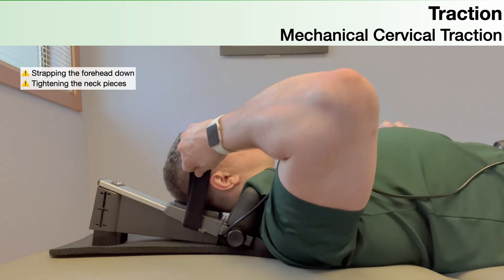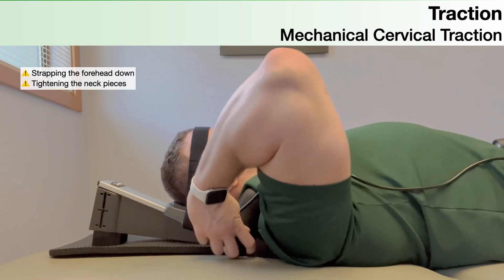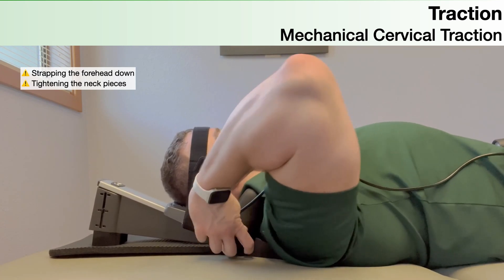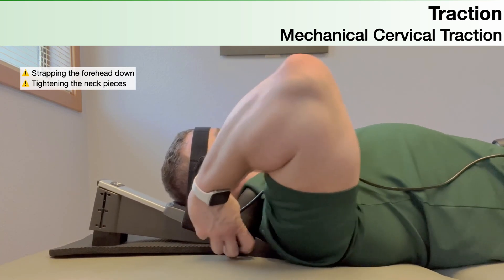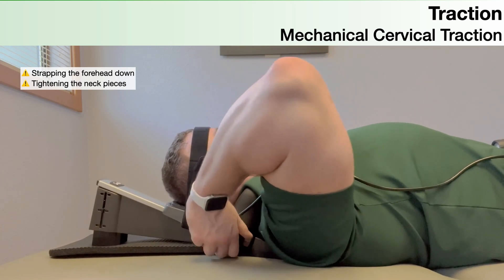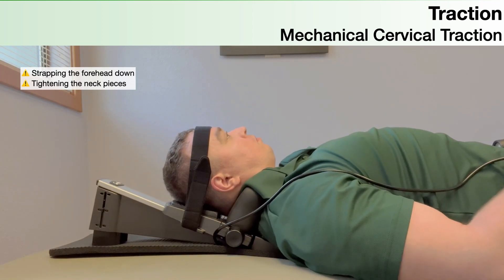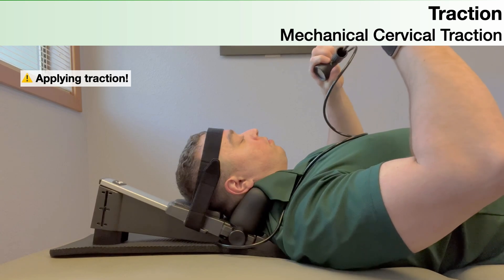Once the person lays down in the traction device, take the velcro strap, wrap it around the person's forehead, loop it through the hole on the side of the device, and fasten it securely. Then take the knobs and tighten the neck pieces as snugly as possible without causing pain or discomfort — if they're not tight enough, the machine won't be able to apply traction effectively.